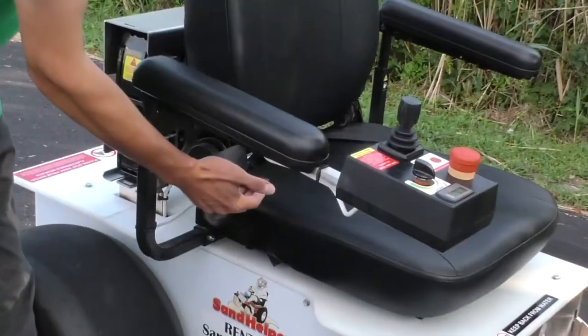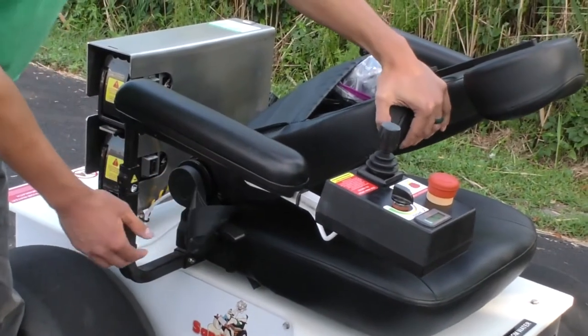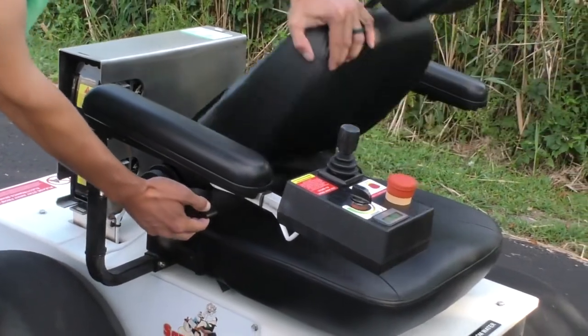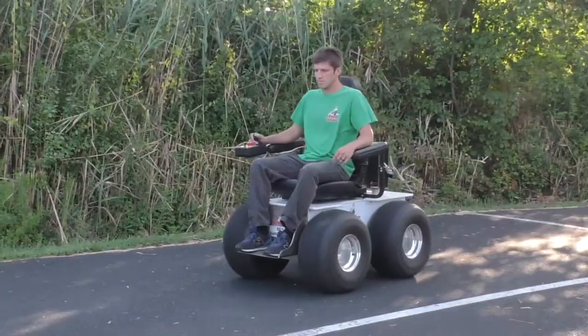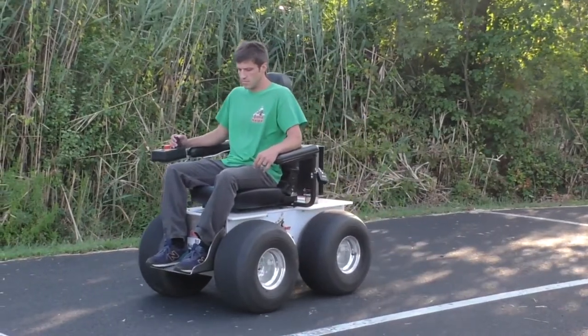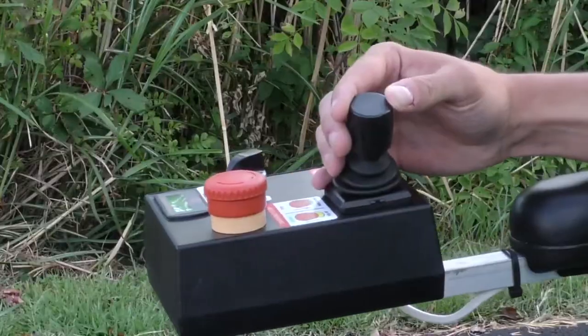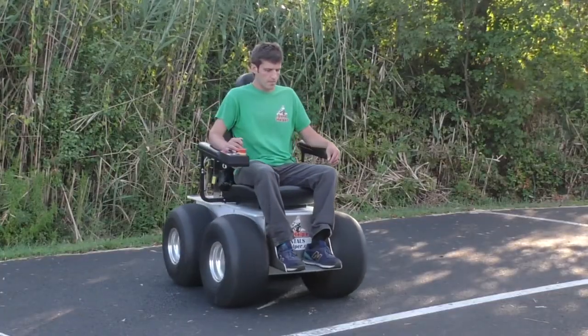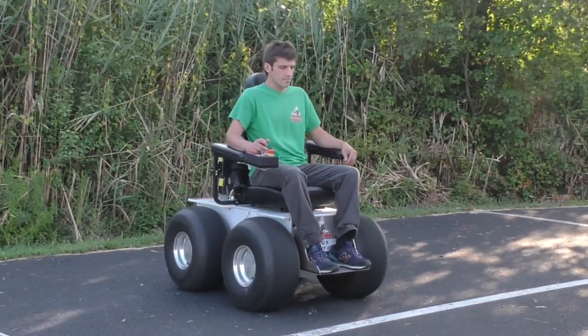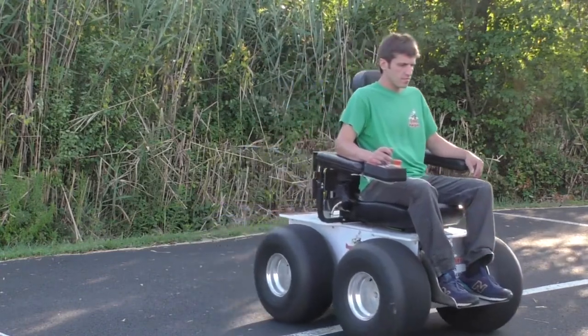If you would like to change the angle of the backrest, there is a lever to the right side of the seat — pull that lever up and it will allow the seat back to move. The best way to maneuver and turn is to stop the wheelchair, spin in place, and then go forward again, instead of going into hard left or right turns while you are already in motion.